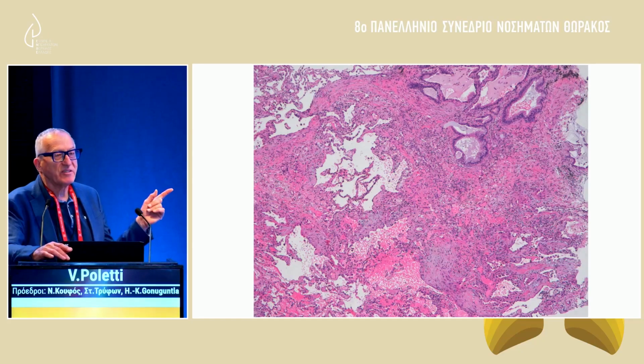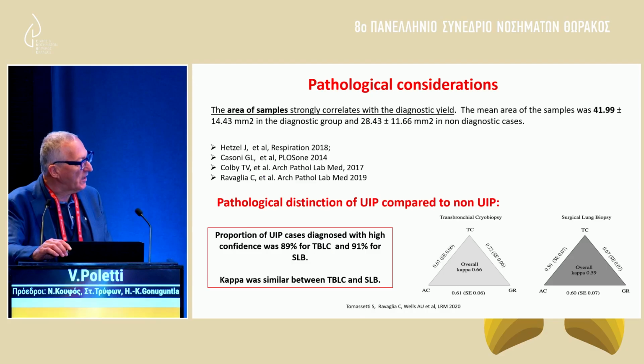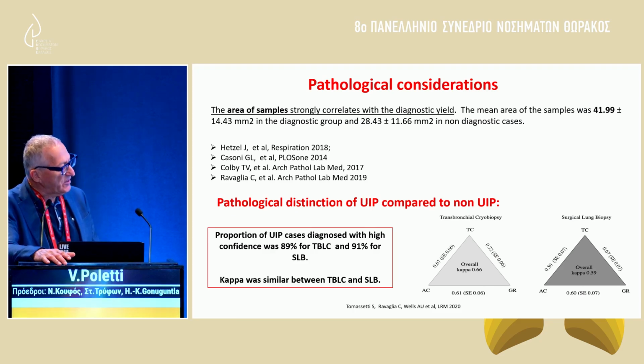Here, in one single sample, all the elements showing this histopathological hallmark. The pathological confidence is good, similar to that assessed in surgical lung biopsy in this study we published some years ago with very good pathologists.